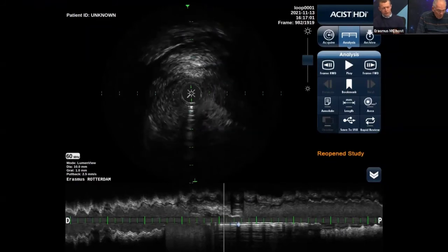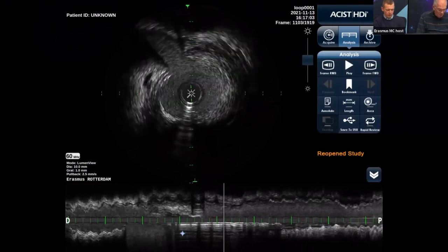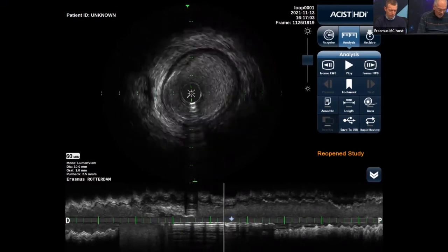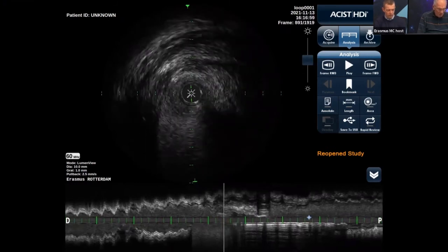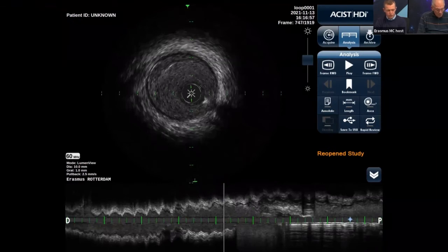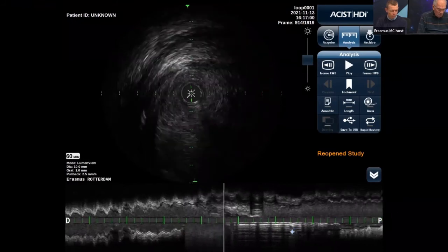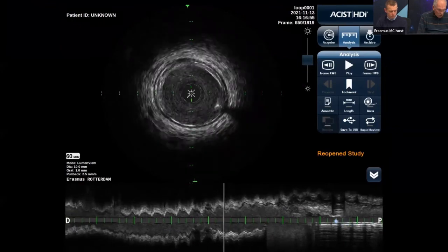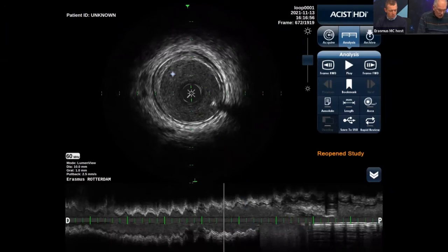So this again confirms that there is a need for further treatment. This MLA of 2.5 or 2.6 here in a reference area. Maybe that is important, Jurgen, because you know that the cutoff for treating stable lesions is around 2.5 to 4 square millimeters if you would rely on IVUS. But an important cutoff that you could use is a percentage area stenosis of 75% or more. And if you would go to either proximal or distal, Jurgen, to a healthy reference area, well, that's not difficult to find here. Yeah. So in here I can call this healthy because it's less than 40.